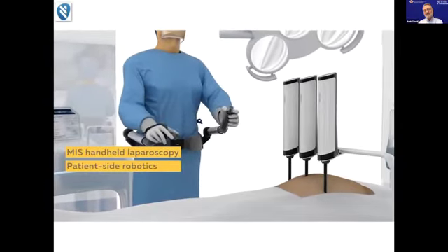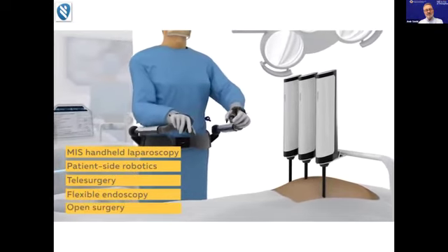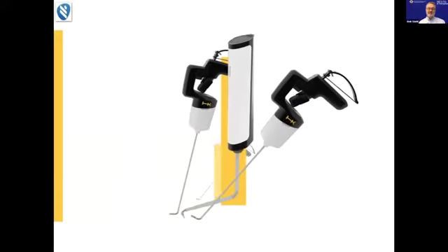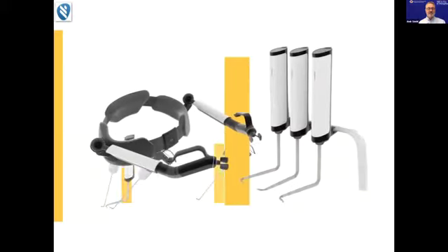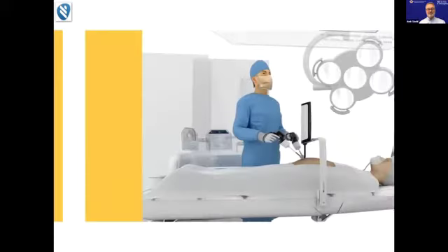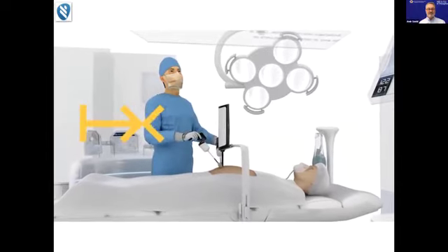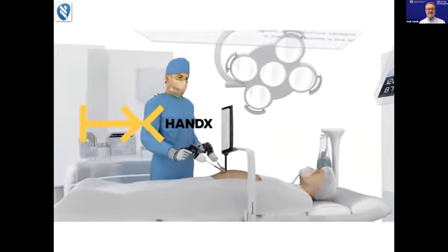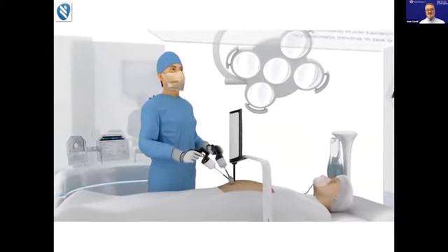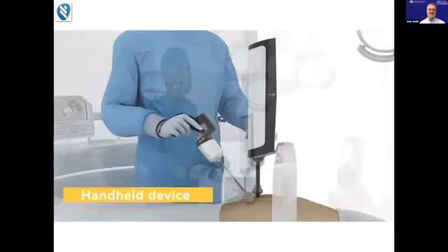I think we should combine something that is bedside, that you can also control from your body, sometimes remotely, and sometimes using a handheld device, and a combination of all that are all orchestrated by a single surgeon. This is of course a vision, it's an animation. Most of it is not products that are on the market, but you can think of holding an instrument in your hand, but also controlling other instruments in the surgical field that could be controlled by the same human interface.